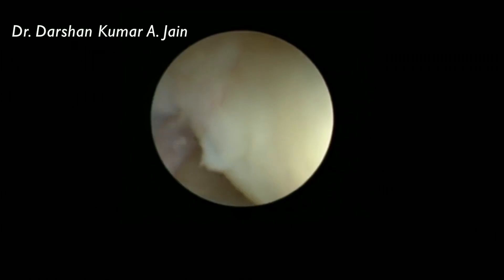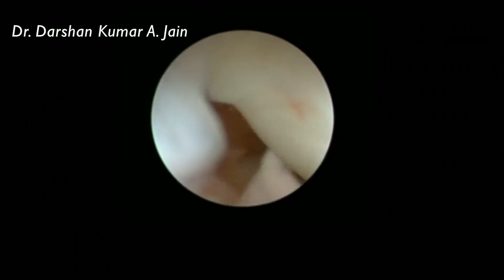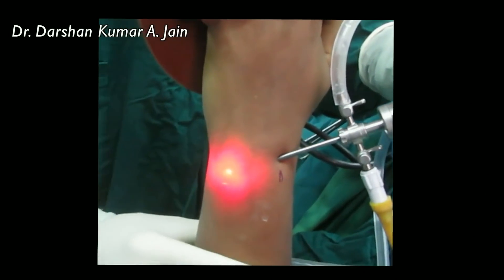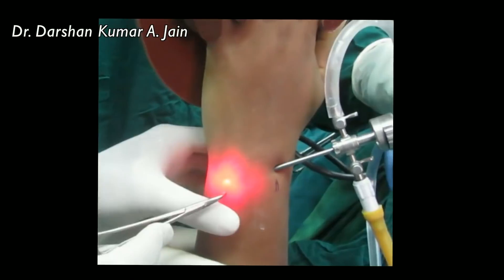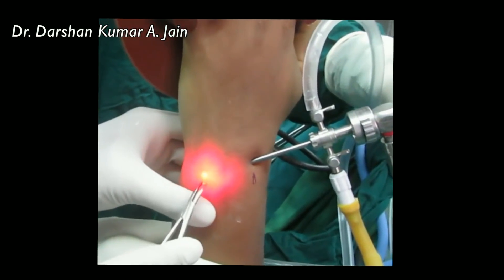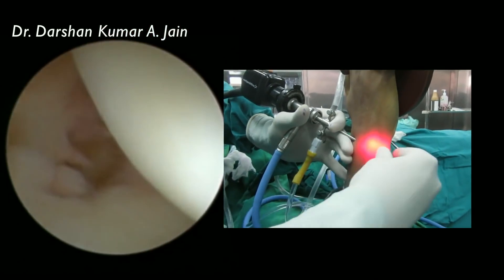Our next step would be to access the ulnar side of the radiocarpal joint by making the 6R portal. We make a 6R portal and an incision just proximal to that, which helps us to deliver the needles if a TFCC repair has to be performed.